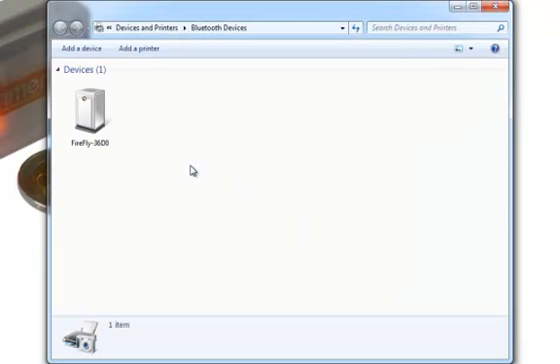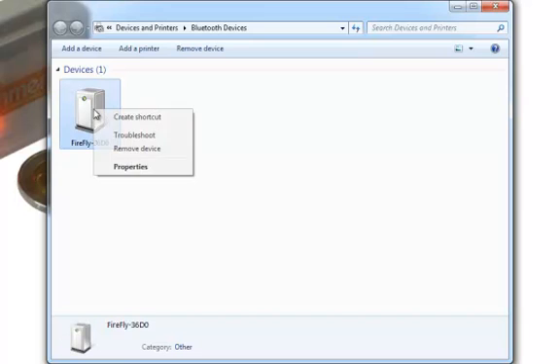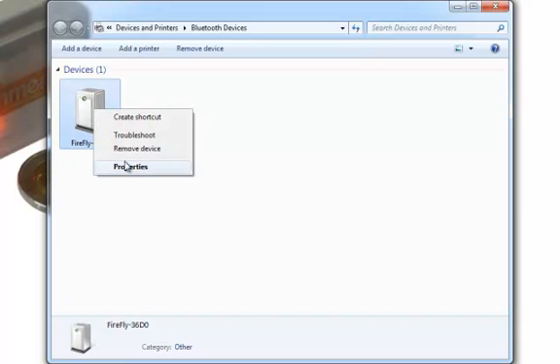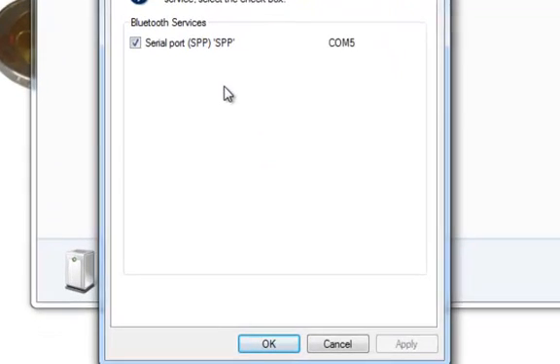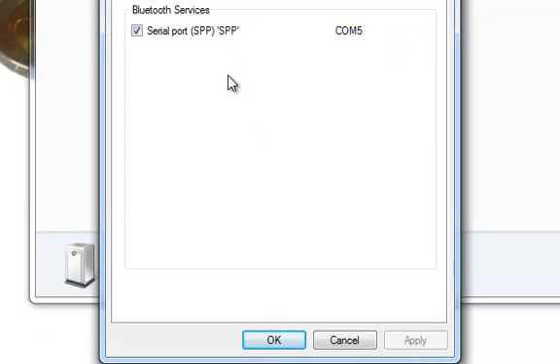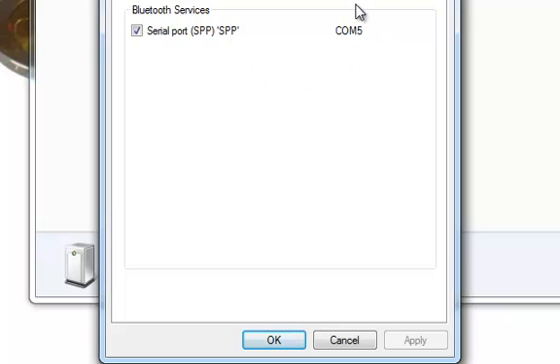I can view the device properties to confirm the serial port that has been assigned. I am looking for the one called SPP, or Serial Port Profile. In my case, the Shimmer has been assigned to COM5.